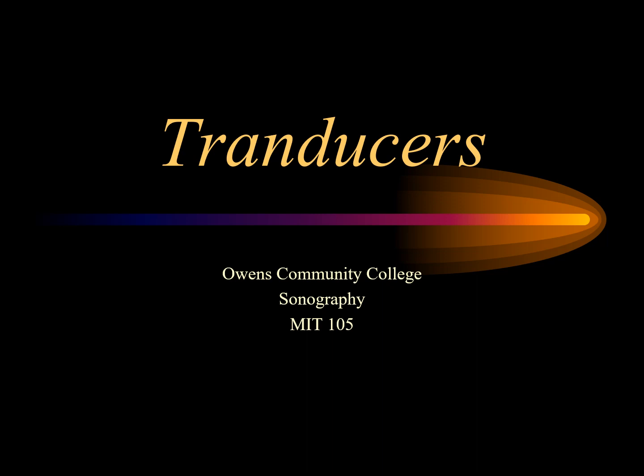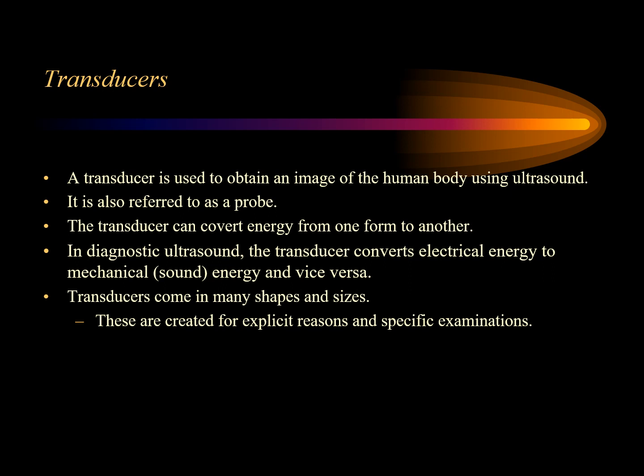This lecture will be all about transducers, a lesson on basic physics of transducers, how they're made, and the components of a transducer, as well as different applications and types of transducers. A transducer is used to obtain an image of the human body using ultrasound. It is often referred to as a probe or an ultrasound probe.